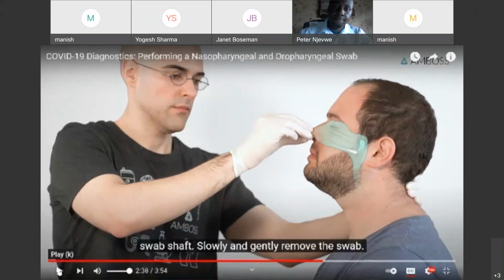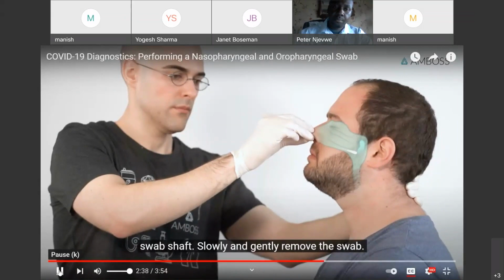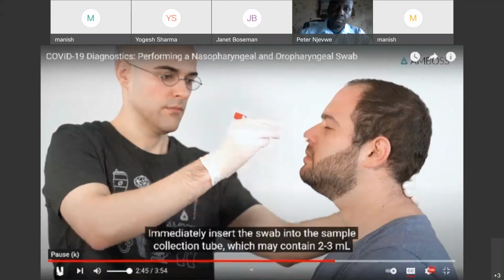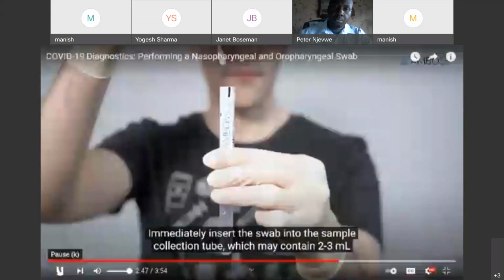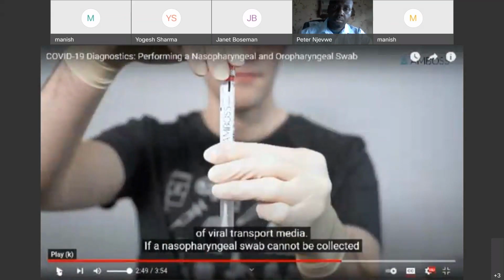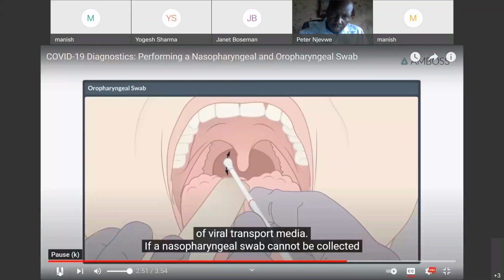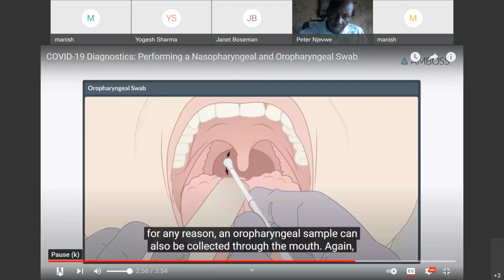We have to leave the swab for a few seconds for the absorbance of the fluid, and gently we should rotate it. And we have to put this swab stick into the transport media. And this is the technique by which we can collect the swab from the oropharyngeal tract.